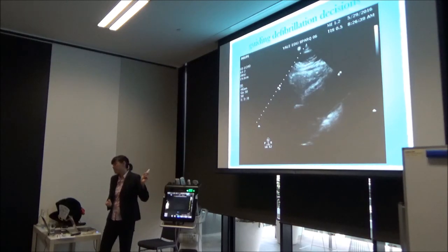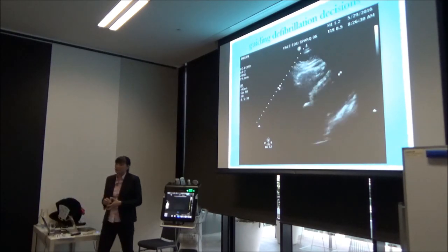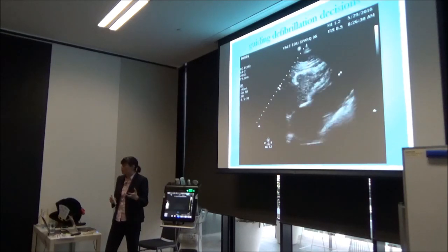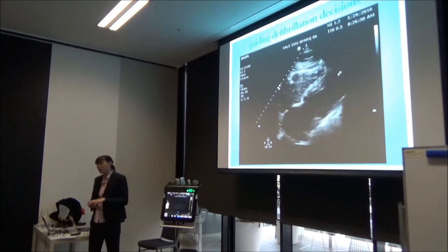What are you seeing here? This won't pick up necessarily on your monitors. And I think this is because, for some reason, the way the electrodes are built, they're not sensitive enough to pick this up, particularly in larger, obese-er people. Is obese-er a word?